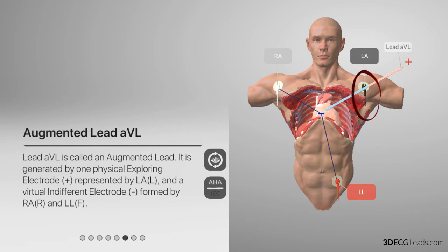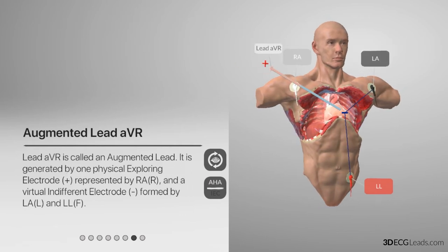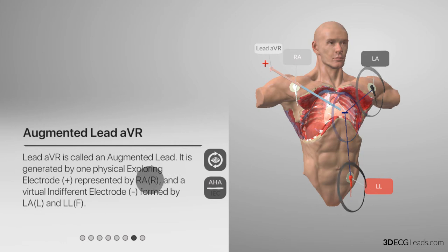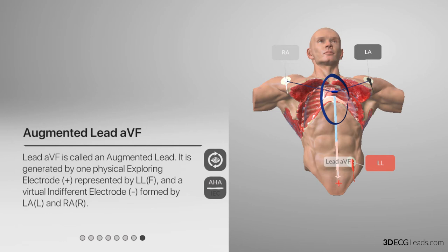Tracing lead AVL has the left arm electrode as the positive electrode and Goldberger's central terminal as the negative electrode. In the case of AVL, GCT is the average of the right arm electrode lead and the left foot electrode lead. Tracing lead AVR has the right arm electrode as the positive electrode and GCT as the negative electrode — in this case GCT is the average of the left arm and left foot electrode leads. Tracing lead AVF has the left leg electrode as the positive electrode and GCT as the negative electrode — in this case GCT is the average of the left arm and right arm electrode leads.